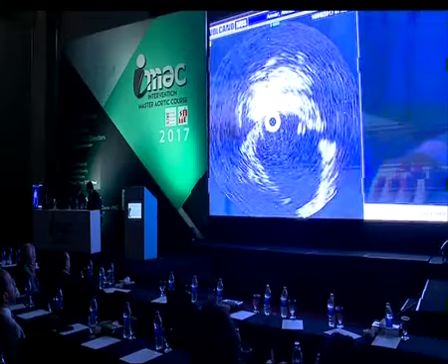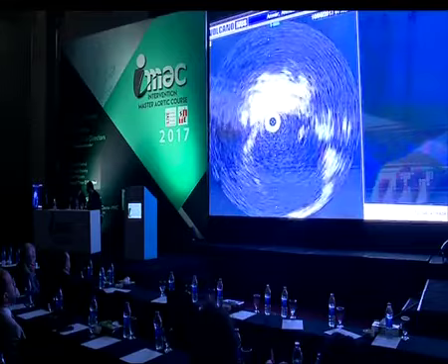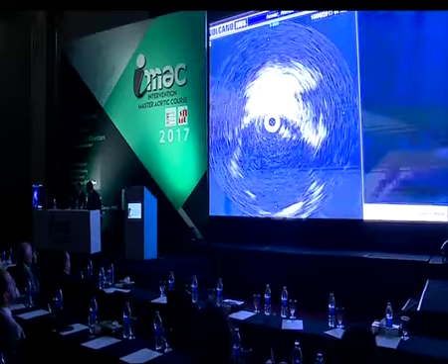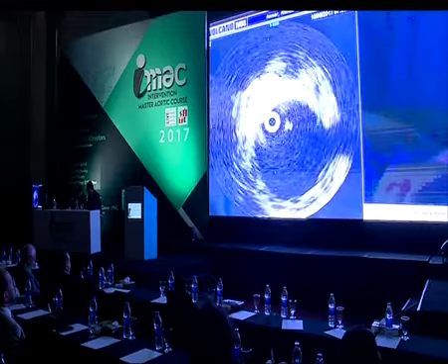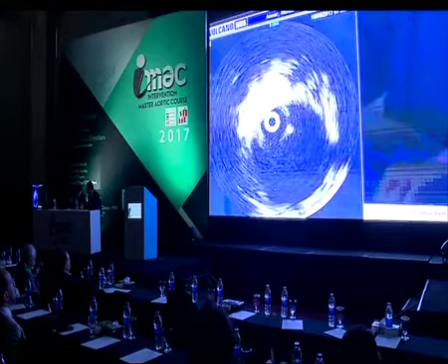So we have a landmark here, the wire. Yes, we can see the wire by the IVUS as well. And here, do you see it working? Can you see it? At 4, yes, at 4 o'clock, yes.